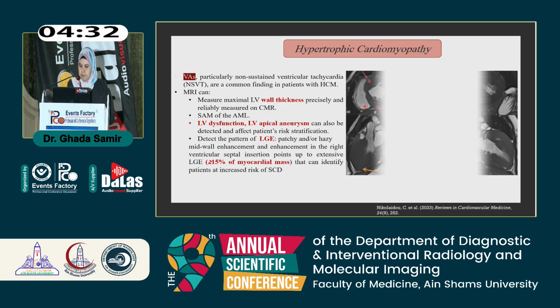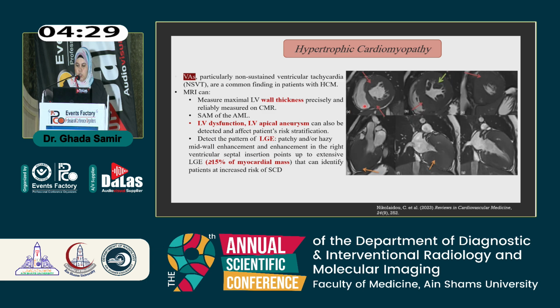In HCM, ventricular arrhythmia, particularly non-sustained ventricular tachycardias, are a common finding. An MRI not only confirms the diagnosis, but it can precisely and reliably measure the maximum wall thickness, which is considered an important 5-year risk parameter for patients with sudden cardiac death.